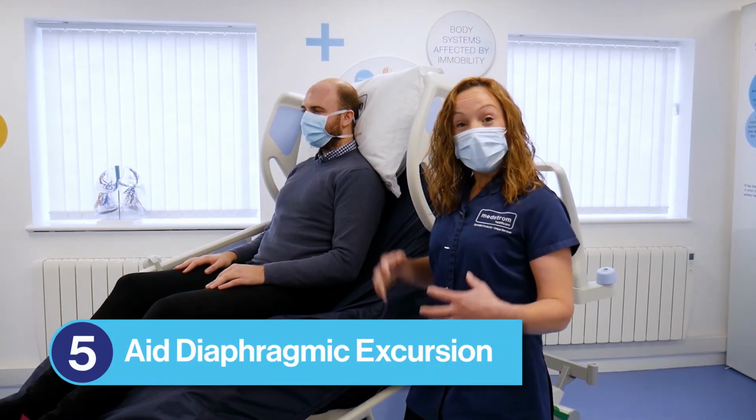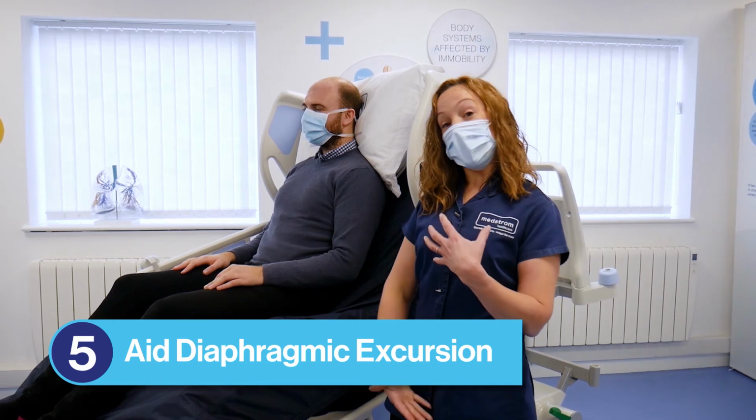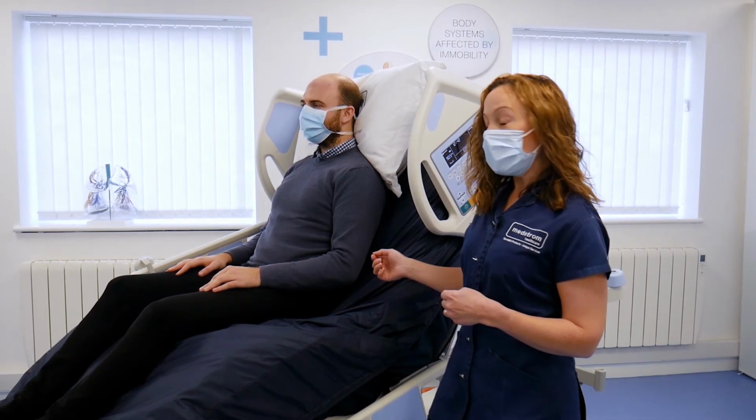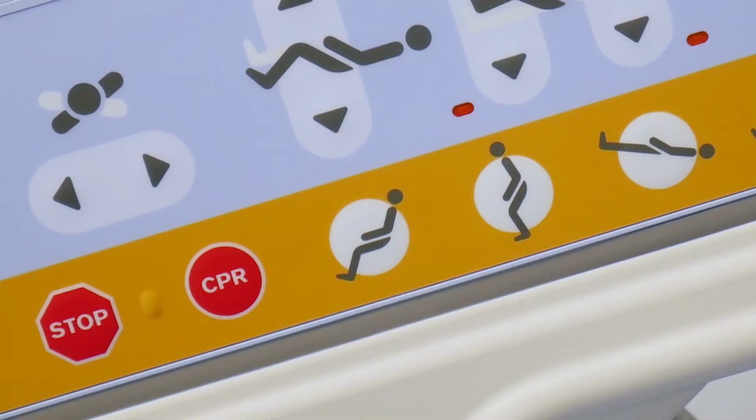To help your patient for their rib cage to come up and out and the diaphragm to lower, it's useful to put them into a full chair position. We'd do that using this button.